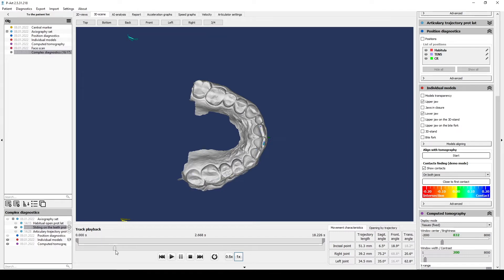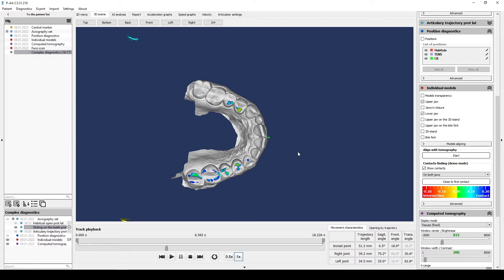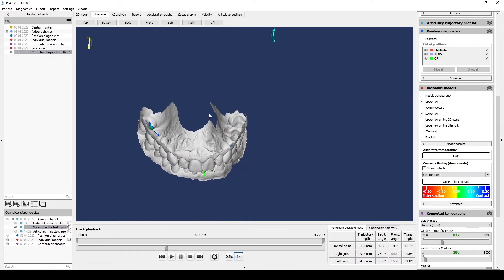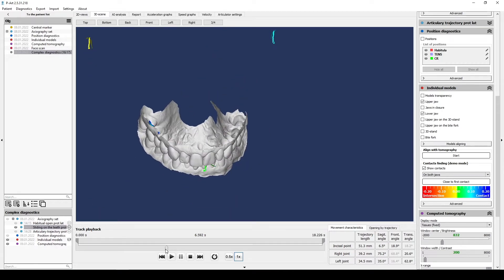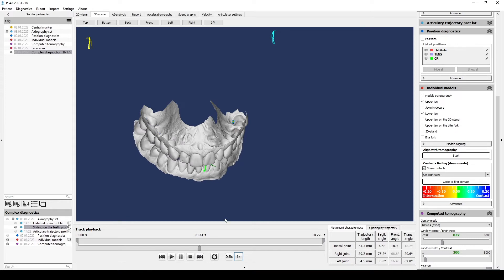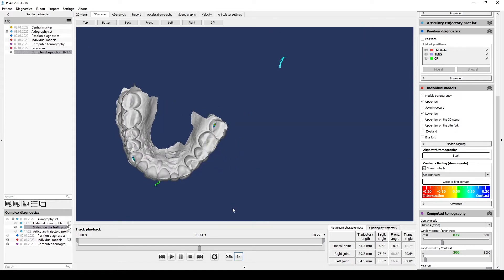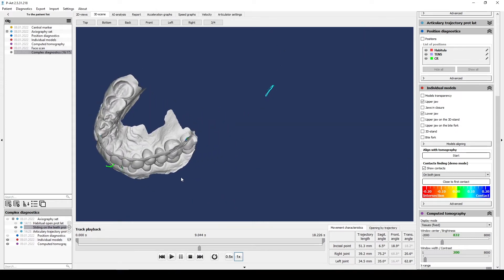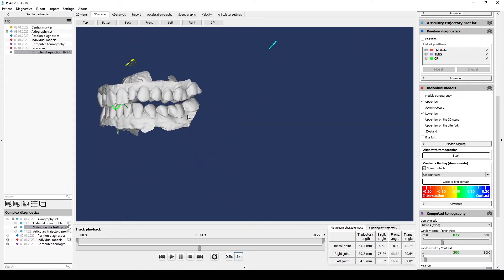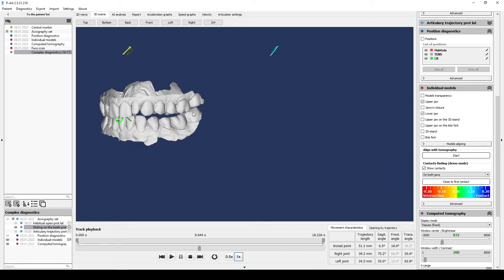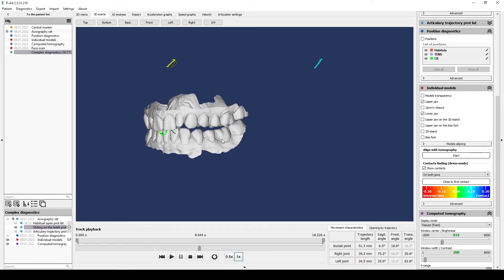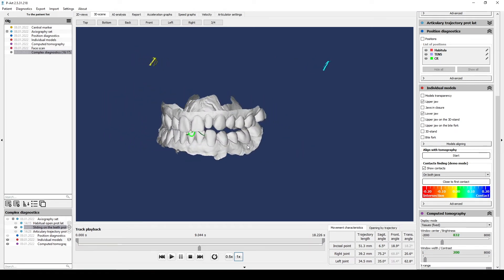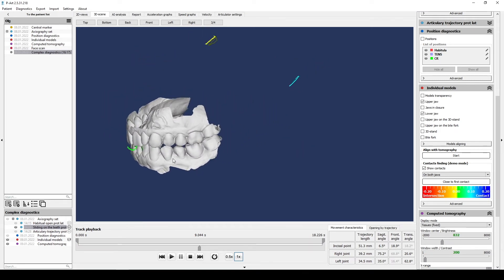Lateral protrusion movements. It's necessary to analyze working side. Here it is a right movement. We check teeth involved in canine guidance, but we also analyze contacts on balancing side. Maybe we have a super contact there.